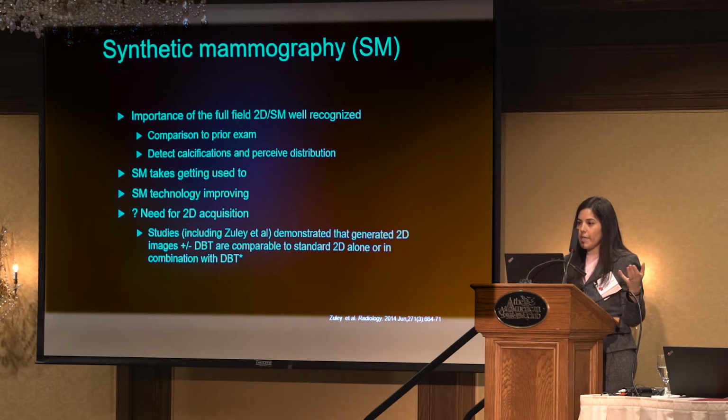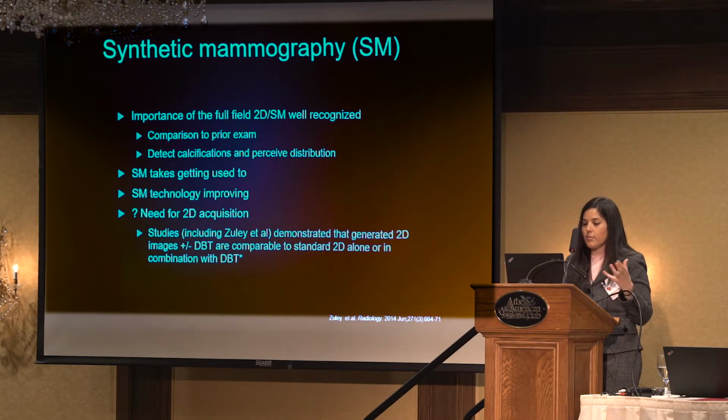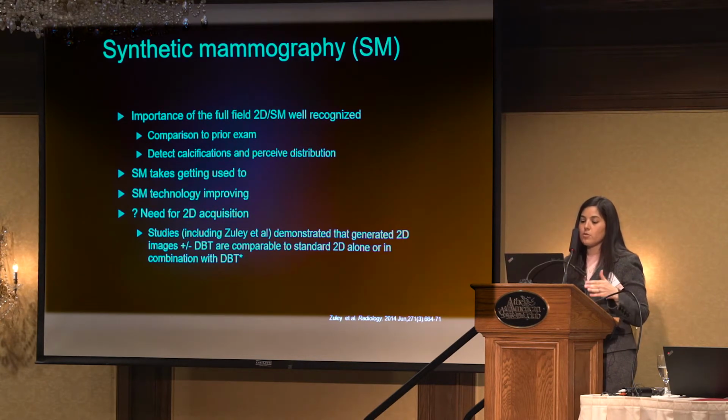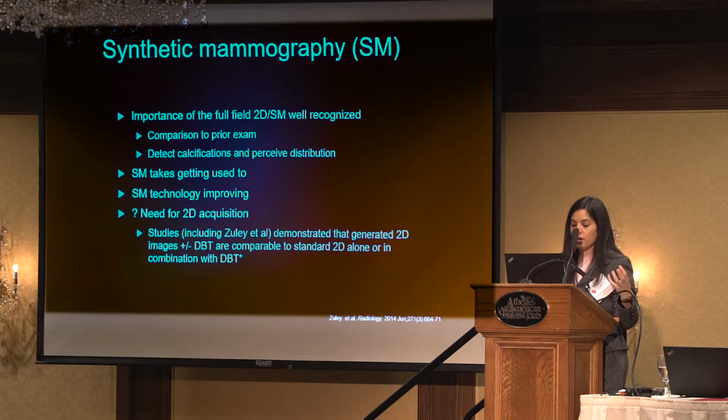So we all know the benefit of having a full field 2D or synthetic. I'm going to call synthetic SM, so don't confuse that for screening mammogram. So the importance of a full field 2D or synthetic mammogram is well recognized, helps you compare to prior studies, and also it really helps you perceive calcifications. It does take getting used to.